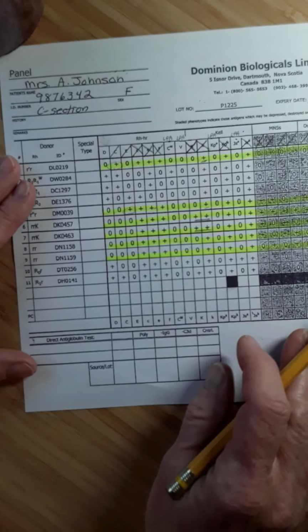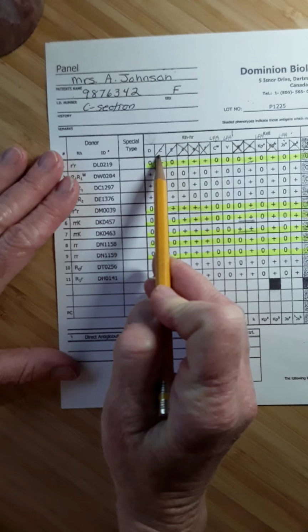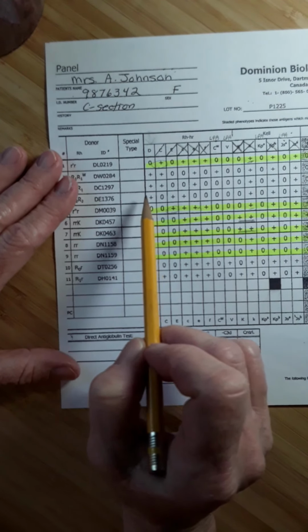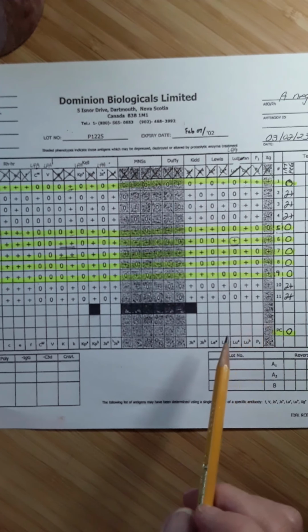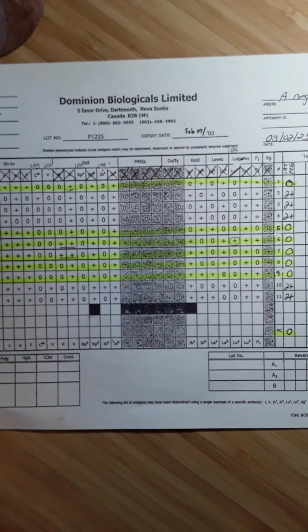So what have I got left here? Really what I've got left is a D with no slashes, a C with 1, and a big E with 1. And everything else is either crossed out or it's a low prevalence antigen. So is the antibody in my patient's plasma a big D, a big C, or a big E? This is the decision that I need to make at this point in time.